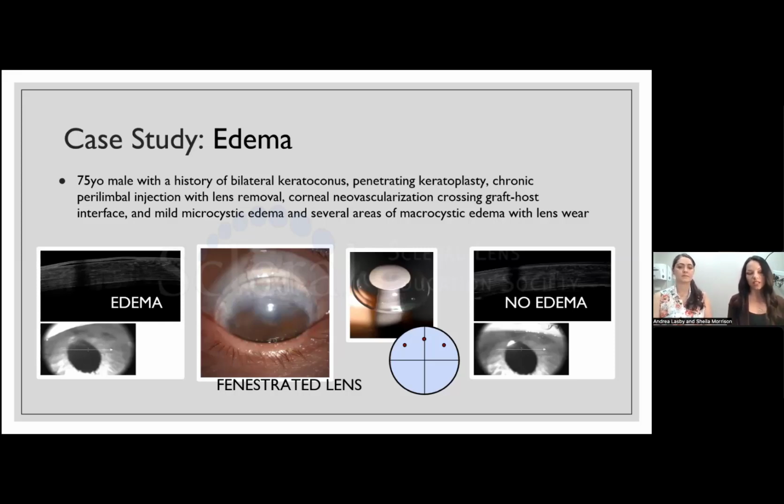So in this case, just a really quick example of how we treated this patient, placing 3 fenestrations that were far enough into the contact lens that they actually gave air to the cornea. If they're too far in the landing zone, then they sometimes help for suction, but they're not really effective for getting more oxygen. And in this case, the patient was a lot more successful.